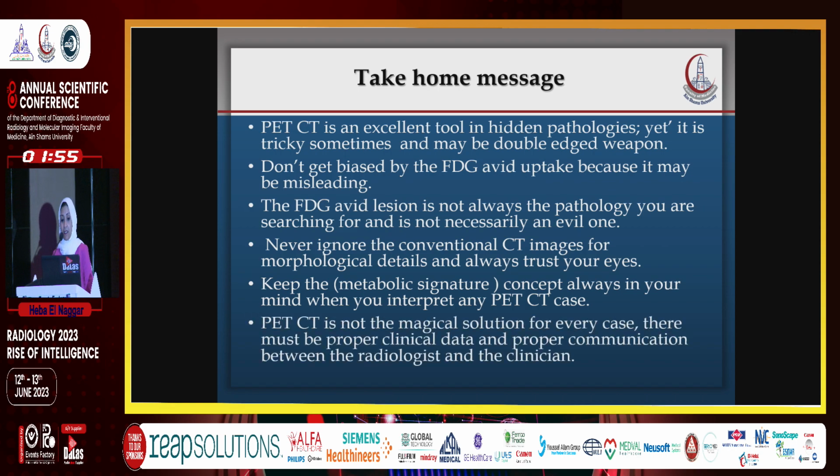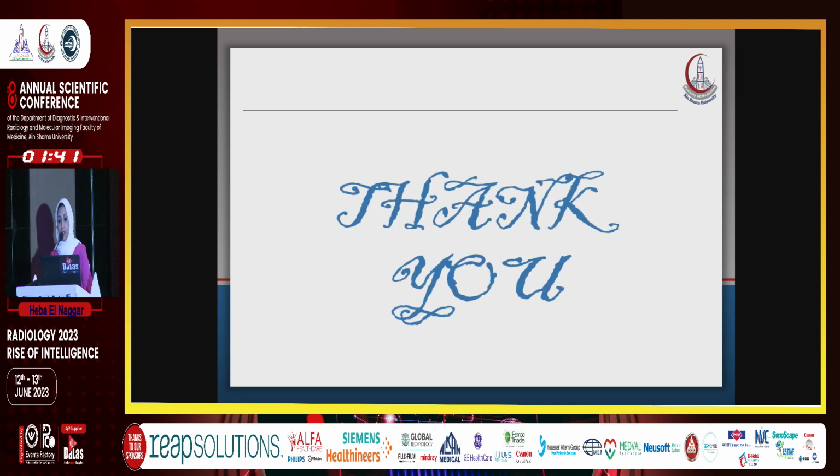Finally, PET-CT is not the magical solution in all cases. There must be proper clinical data and proper communication between the radiologist and clinician in order to reach a final proper diagnosis. Thank you.